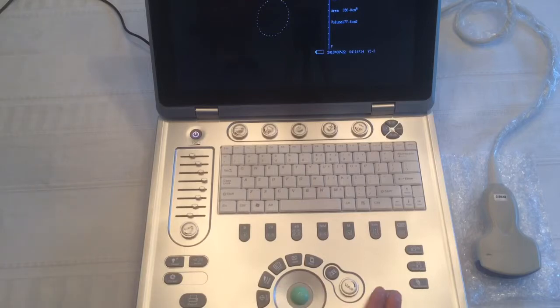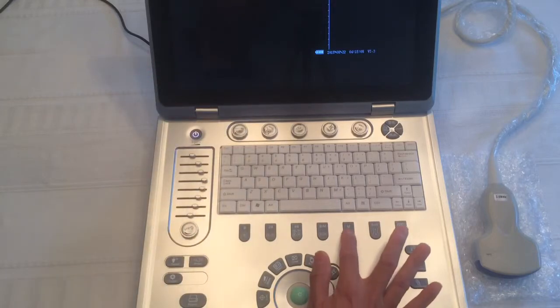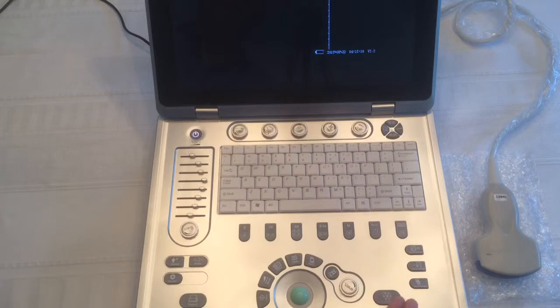To measure heart frequency, heart rate, let's unfreeze. Okay, we do clear, unfreeze. So we're doing a live scan. There's no F. You have to go to M mode. Okay, and then freeze the image again. Freeze. Measure. You go to the first peak, enter. Second peak, enter. And that's the heart rate.